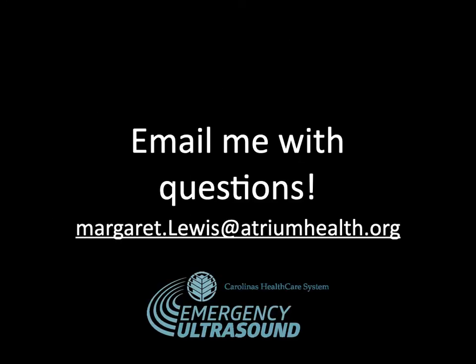So that's it, folks. We've had a little bit of discussion about gallbladder ultrasound and some of the big things that we look for when doing a right upper quadrant or gallbladder ultrasound, just a point of care ultrasound.